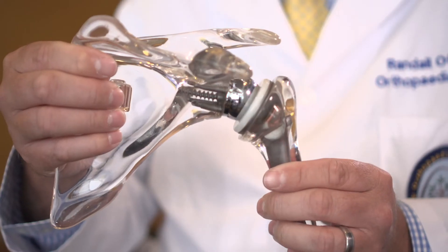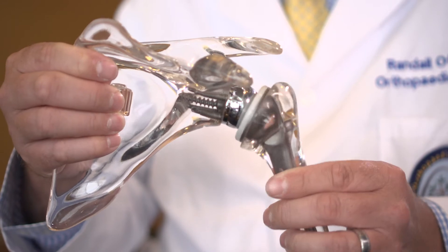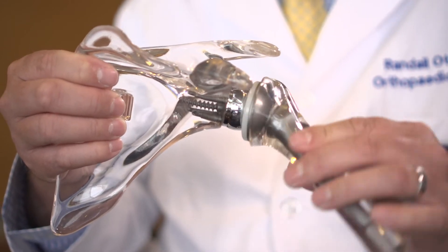Why would you do a reverse shoulder replacement? The reason is because it has a built-in constraint — the ball sits into a socket that helps to hold it in. So anything where there's a potential problem with instability, where the ball is dislocating, or if there's a big rotator cuff tear where the muscles supposed to hold the ball into the socket are torn or not working, those are the types of things the reverse shoulder replacement can help to restore so that you can raise your arm and use it.